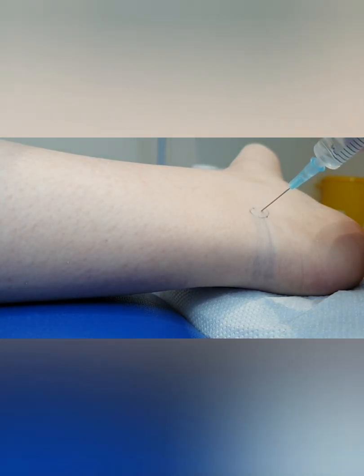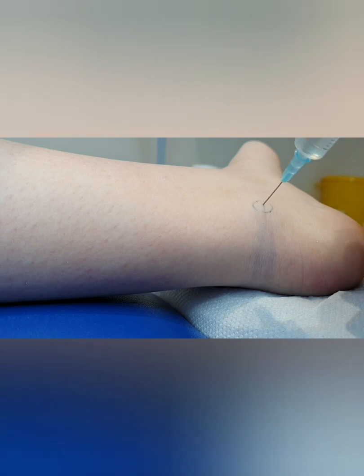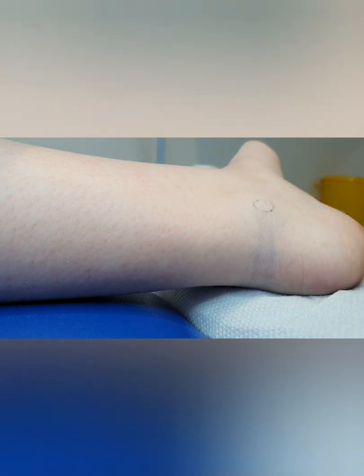And what I'll do is I will inject a certain amount of anaesthetic, with the intention that it will knock out and numb the undersides of the sole of the foot, or at least the majority of it. It's not that bad an injection actually. There are other ways we can inject for needling, and we can go in the sole of the foot, but that tends to be a little bit more of a painful injection. Like I say, this one isn't that painful at all.